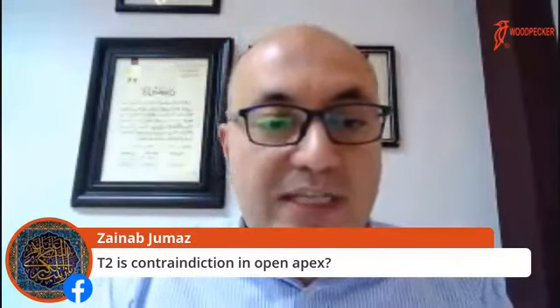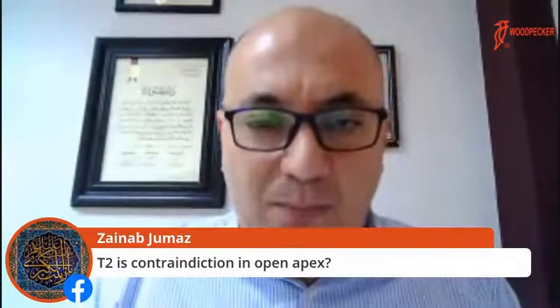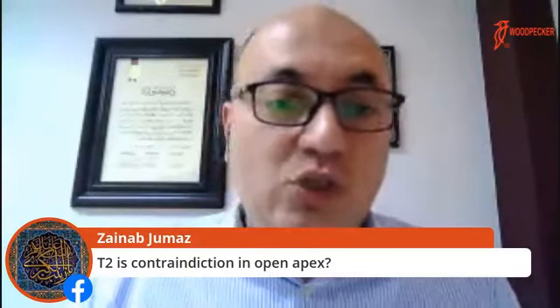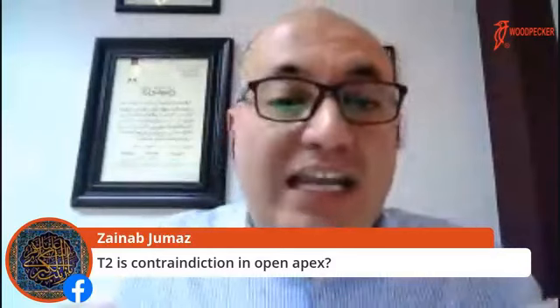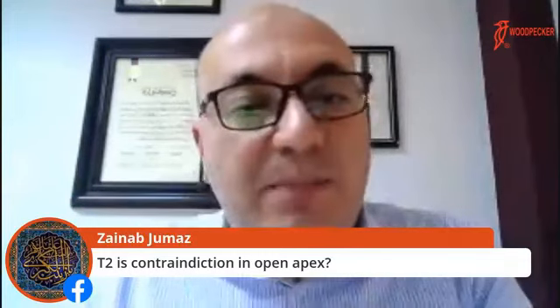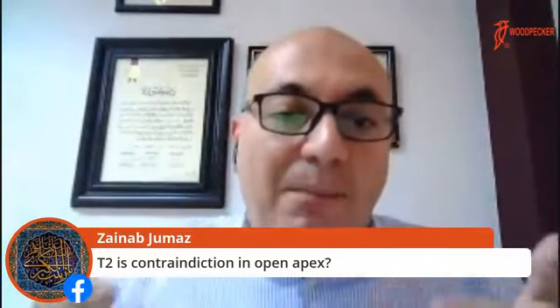Zainab is asking whether the T2 is contraindicated in open apexes. You have to understand something very important. Whenever we have an open apex, it's more important to pay attention to why we are irrigating with sodium hypochlorite. If you think that the active irrigation will be pushed out of the open apex and cause an accident, this is actually not correct, because it does not have injection forces. Why? The liquids are coming from the top, not from the tip. Again, Zainab, when we have an accident of sodium hypochlorite, this is because the delivery of sodium hypochlorite is coming from the tip, which was out of the apex. But here the liquids are from the sides, from up and from the sides.